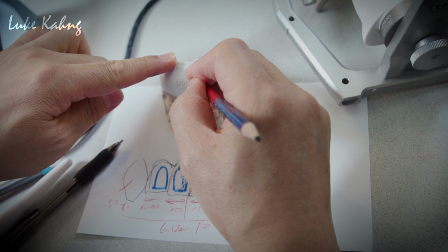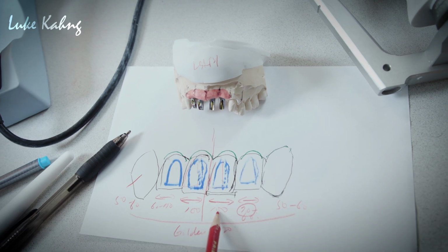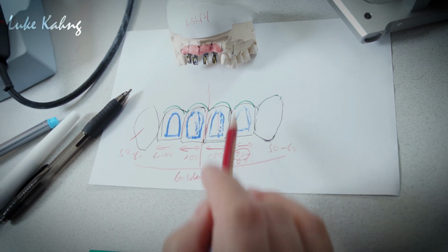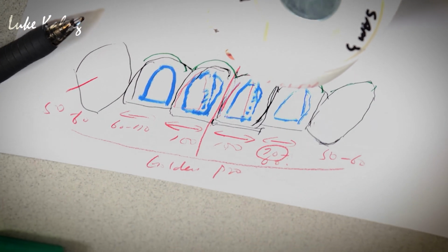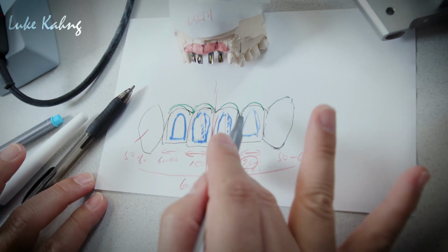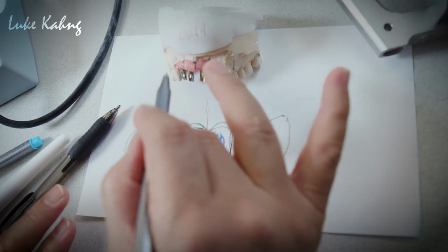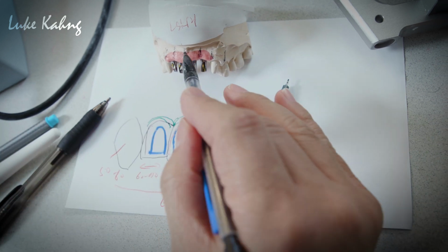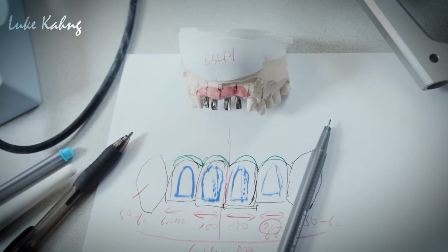Don't get confused. Okay, and let's look at the one-to-one design. Fine. Midline, draw the line. 100%. Draw the line. 60-70%. Same thing, canine. So the canine will be overhanging here in order to make the cosmetic design. Make sense? So this is number one. Dental laboratory technicians never listen. Draw the line. If we don't know how to draw the line, you have to keep on using your pencil, and then you have to draw. Then you can see, this is a huge problem. So this is number one.